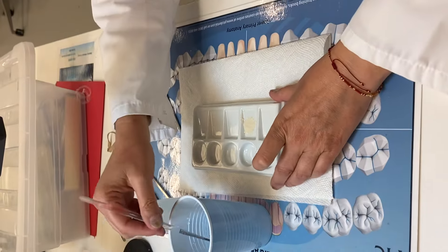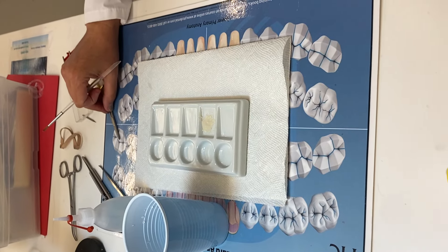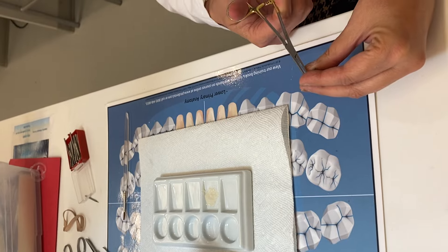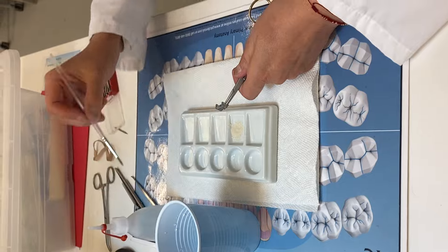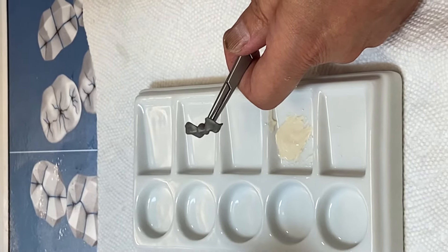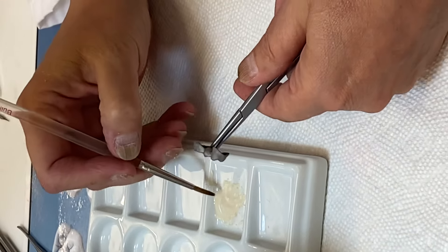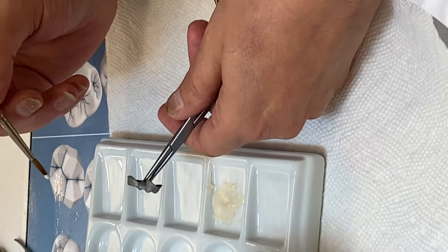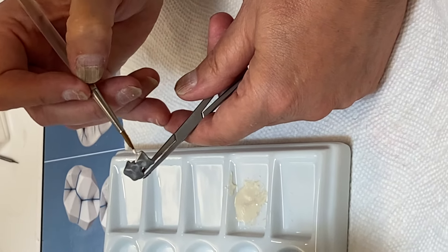I have my paste, I have my brush clean, and then I'm going to take my framework and apply my opaque layer. The first opaque layer is going to be like a wash — a thin coat.